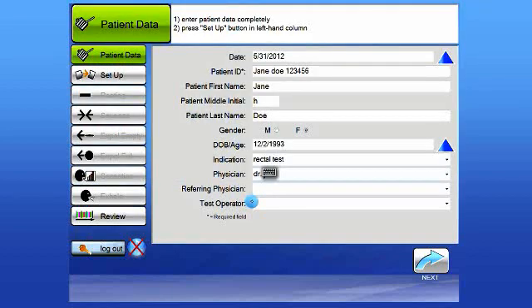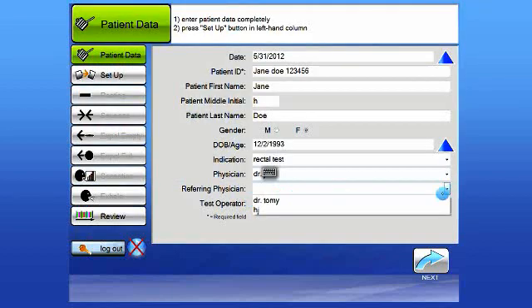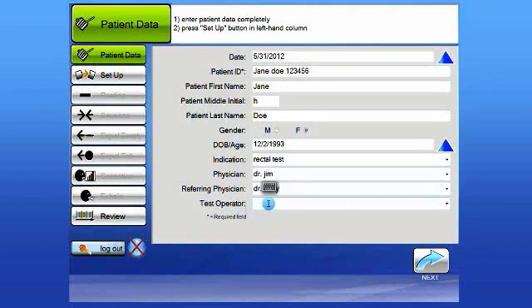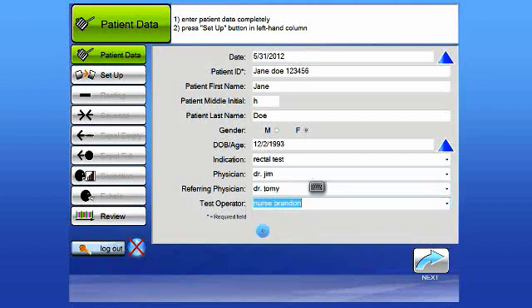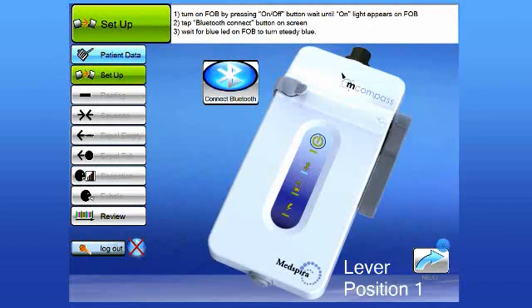The next field is the Referring Physician. And finally is the Test Operator. This is the clinician that is actually performing the test. Again, the only required field is the Patient ID field. The rest is optional. Once you've completed that section, tap the Next arrow in the lower right corner of the screen.